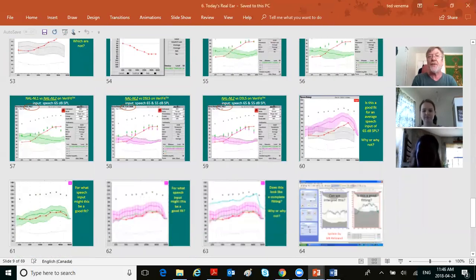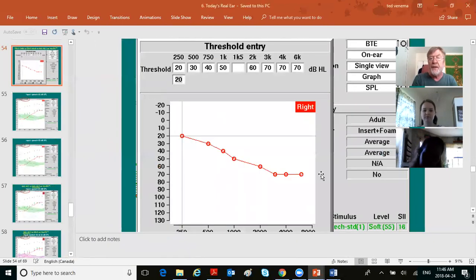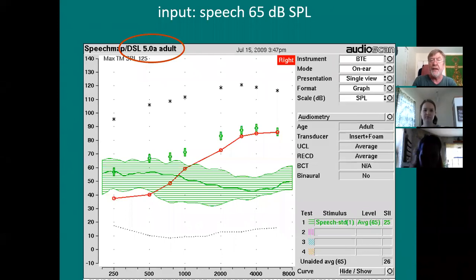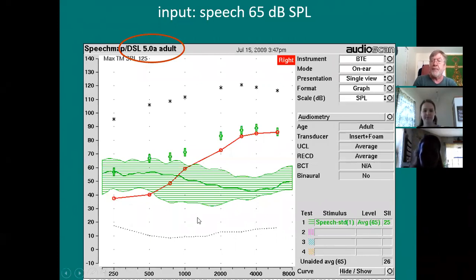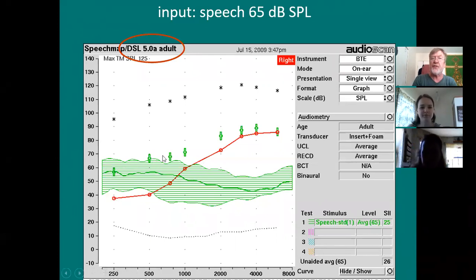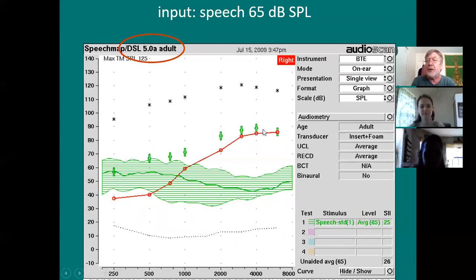So back to where we were. You're looking at a hearing loss, and looking at what should be happening. Unaided speech is the green — the mean is the line, and the range is top to bottom. In general, the mean is not in the center of the range, and we know that's because speech is a very staccato, stop-start type of situation. Here are targets for DSL-5. Notice these targets in the highs barely are above the thresholds.